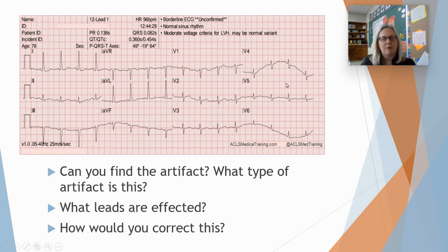This mimics, remember, it mimics the breath patterns. And you can tell which stickers are affected because you can look at the leads. This is V4 and V6. They are located down here, right? V4 is mid-clavicular, it's intercostal, and V6 is in the armpit. So those two are probably too close to the diaphragm because this is wandering baseline.